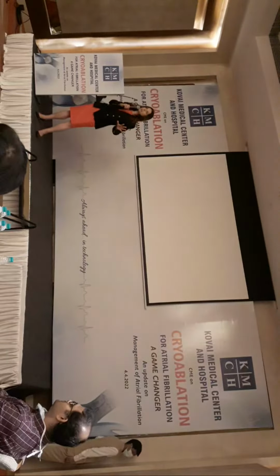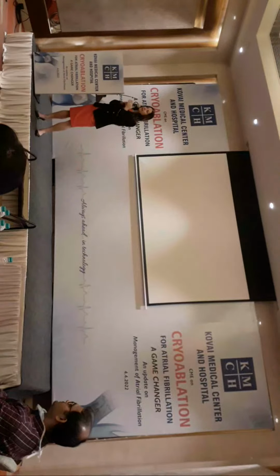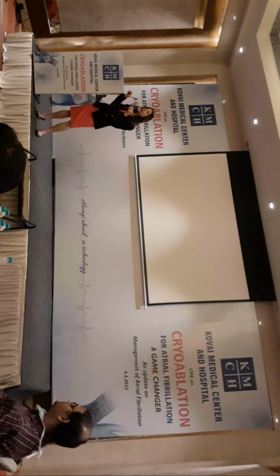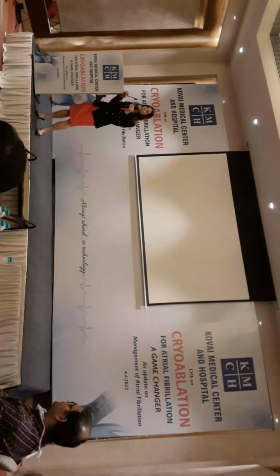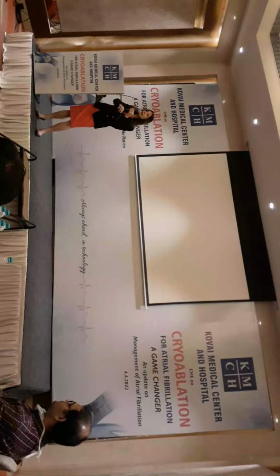And before you lose palpated capture, if the CMAP, compound motor action potential, starts to diminish, we come off. The staff know that's a double click off or a press and hold, which is an intentional deflation of the balloon, so we don't continue to freeze the phrenic nerve. So the compound motor action potential is a great way to catch the phrenic nerve starting to get too cold before it actually stops capturing.